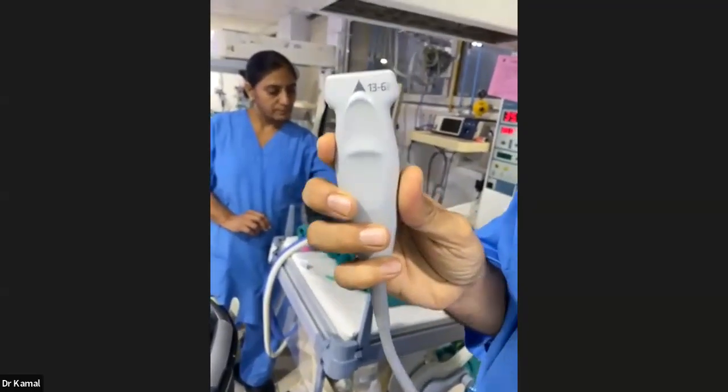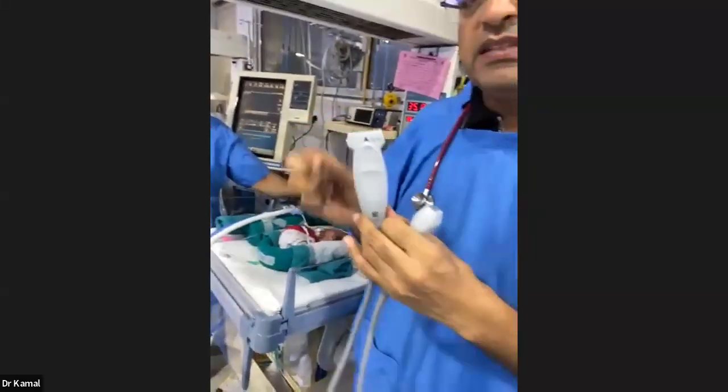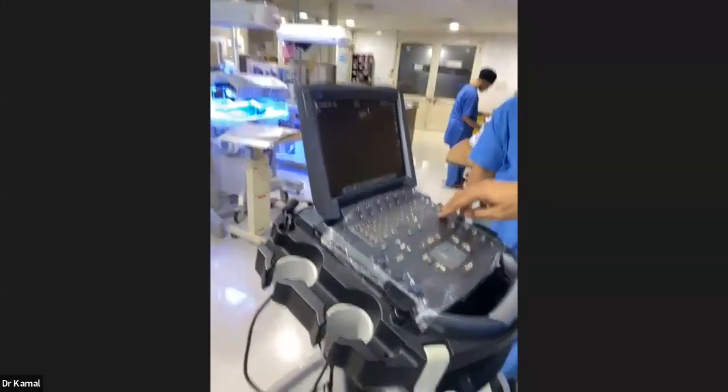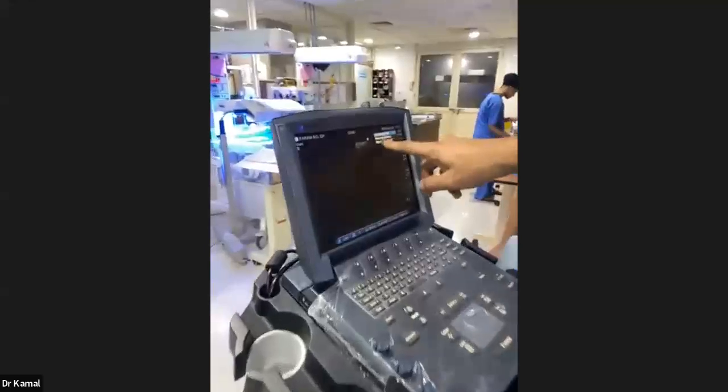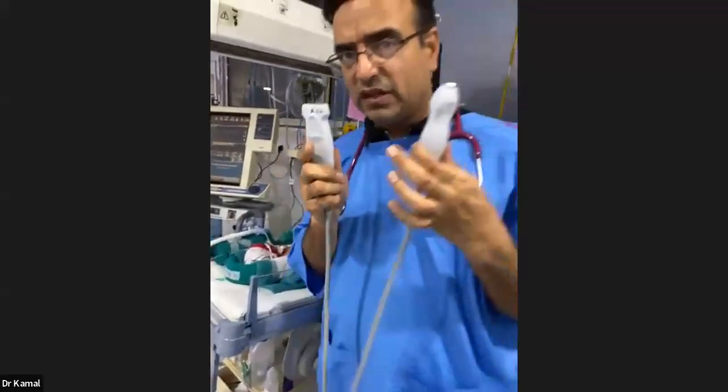Okay. And on this or this, like it is written over here, 6 to 13 megahertz. So this 6 to 13 megahertz means it can change its frequency depending on what structure you are doing. You can press over here, and then you can press over here the exam button. So the cardiac, neonatal, or abdomen. So it will change according to which part you are imaging. Okay. So this is 6 to 13 megahertz, and this is 4 to 8 megahertz. I think clear about the transducers.